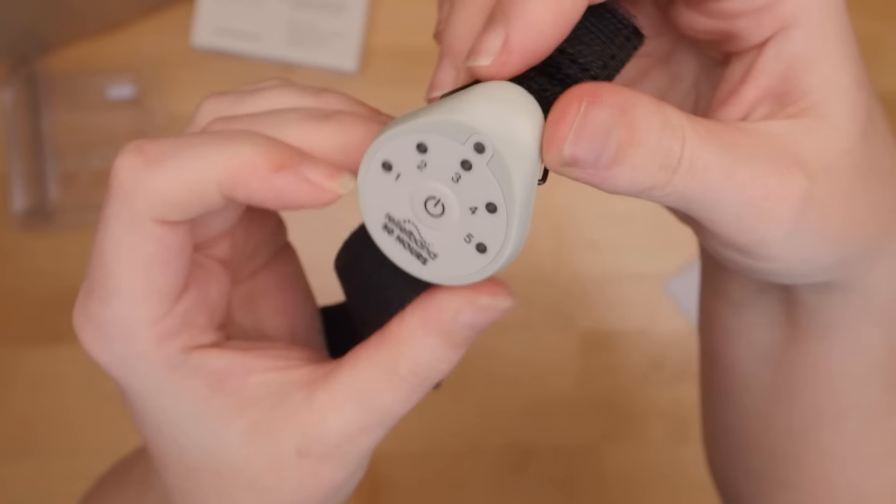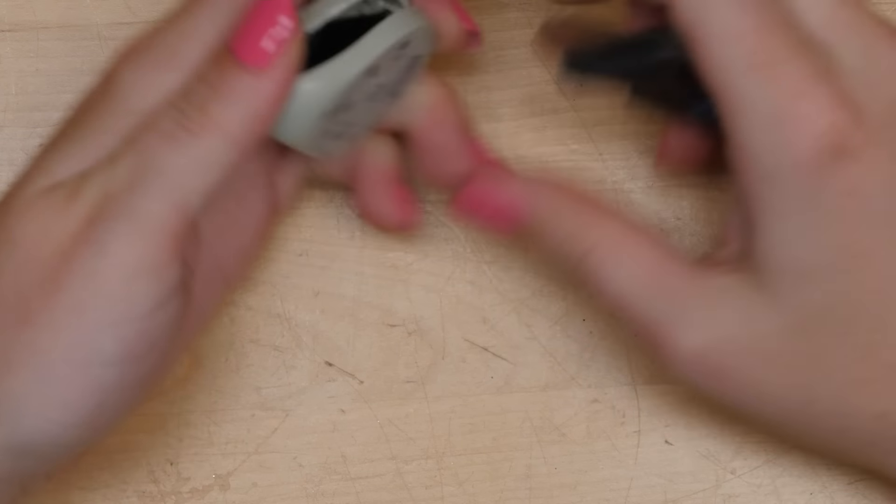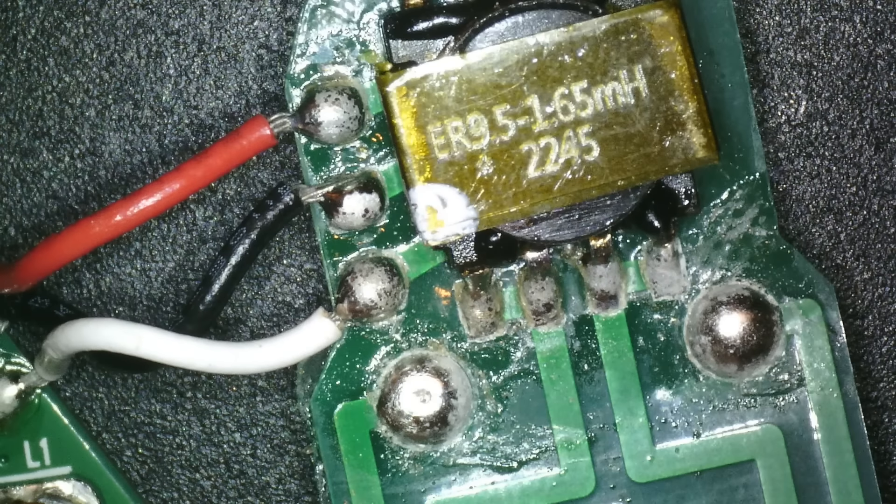Welcome to another teardown. Today we're looking inside the Relief Band, a motion sickness wearable. Keep watching to see me try it out, take it apart, and analyze the design and manufacturing of the circuitry inside.